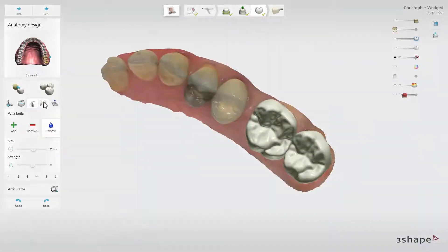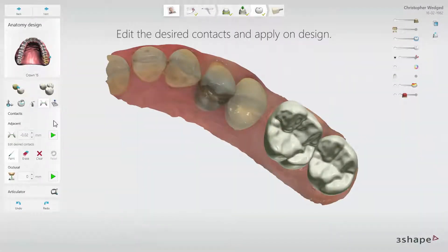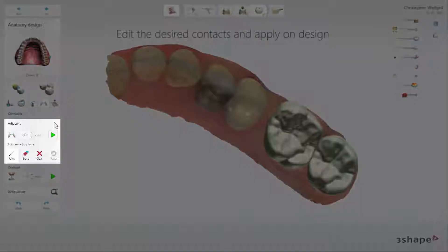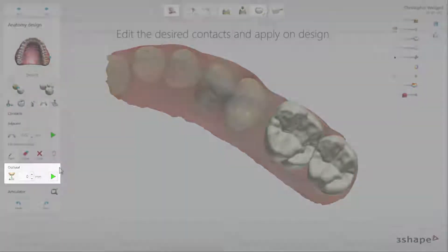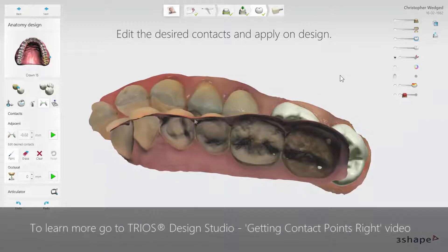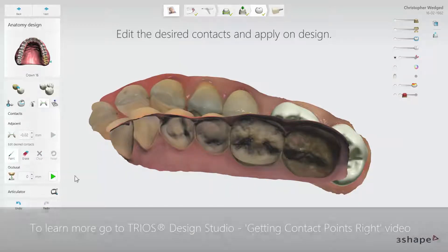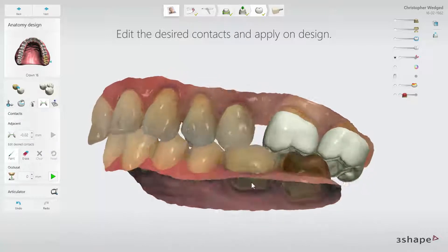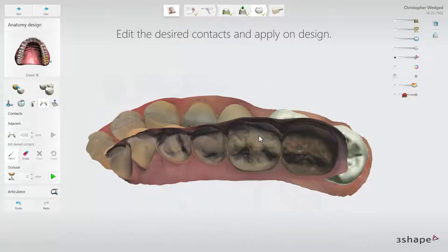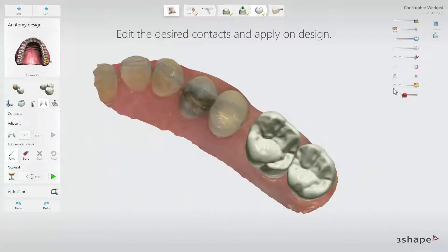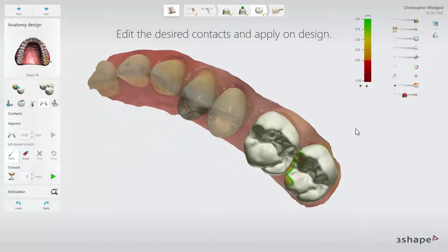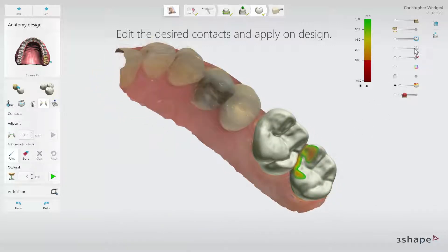In the Contact tool, you will find options like Adjacent, where you can set the values of contact points as well as the shape and size if a tooth requires it. Occlusal will allow you to adjust the design to the antagonist. When you work on both types of contact points, it is good to use the Show Distance Map slider to have it visualized.